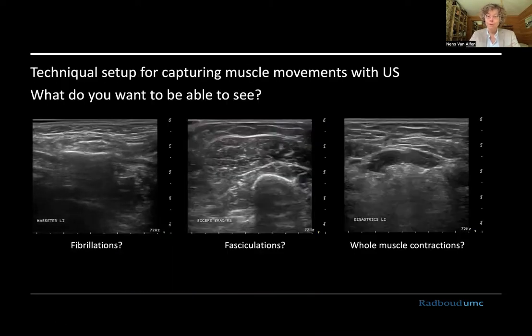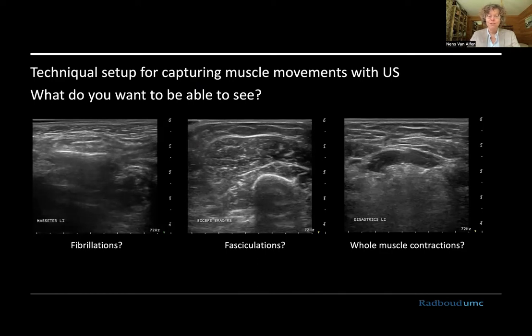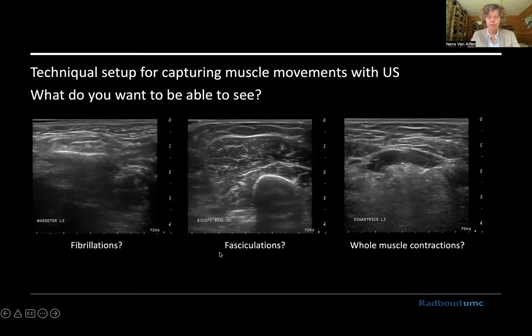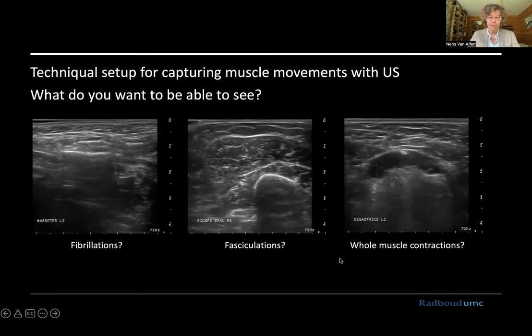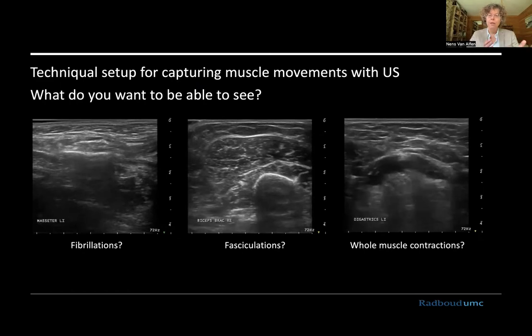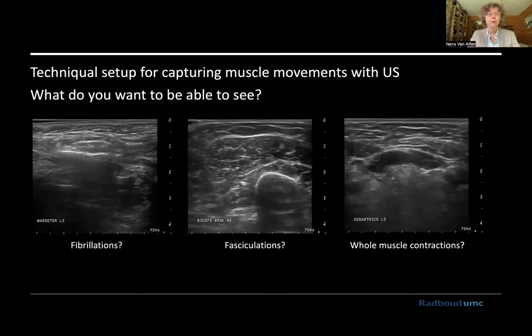So if you want to capture muscle movements with ultrasound, it elicits the question up front of what you want to see, because there is a slight difference in the technical setup. If it is, for example, fibrillations — the video is already running here on the left of the screen — then you need different settings for your ultrasound equipment than if you want to see fasciculations, or whole muscle contraction during swallowing. The image and the size of the moving structure become progressively larger, and that means you need to tweak your settings.